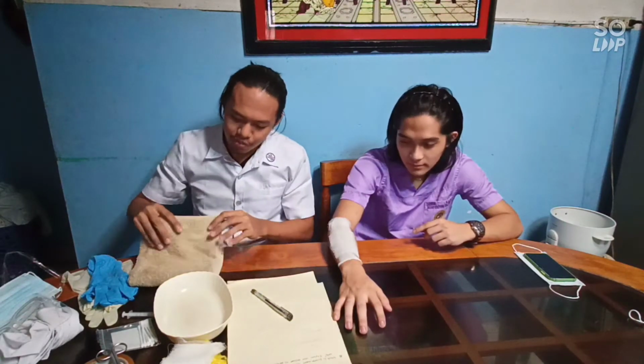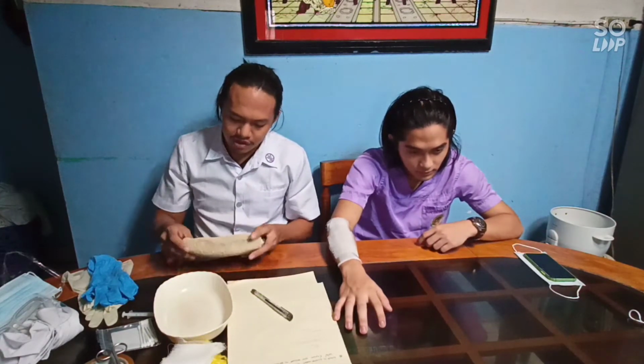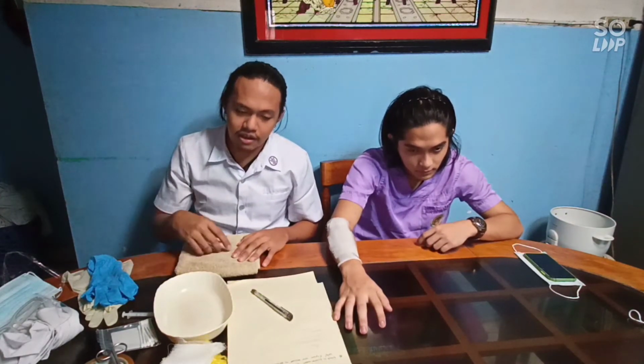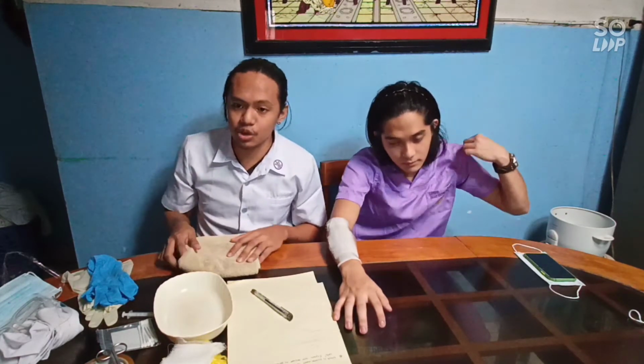Okay, catheter. Then we also have our waterproof blanket. This is important so that all the fluids or liquids will be absorbed in here later during our procedure. Our alcohol for the hand hygiene, normal saline as the doctor's order. Then we also have our PPEs in here, the face shield, mask, apron, and our gloves.